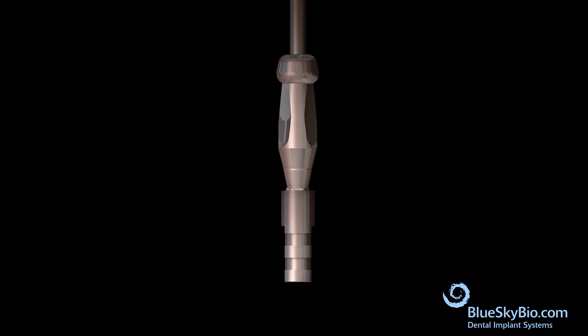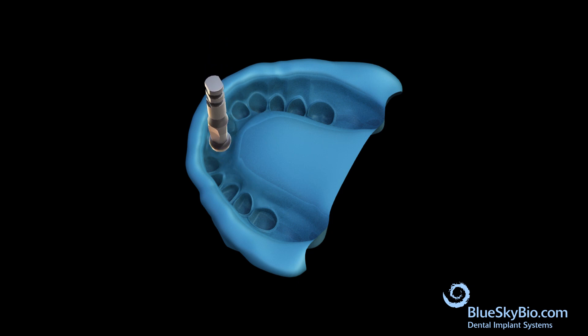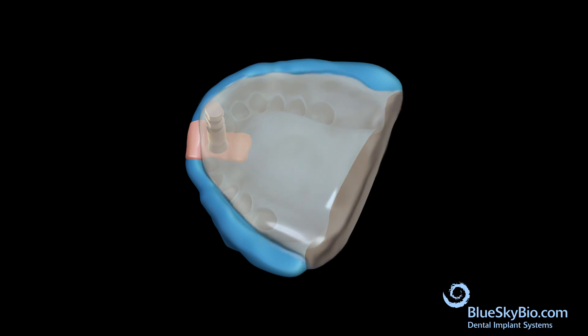Attach the impression transfer to an analog. Orient the impression transfer analog assembly so that the flat surfaces of the transfer match the flat surfaces in the impression, and then fully insert into the impression. Inject pink soft tissue model material around the analog. Pour model stone in the impression and a model is made.